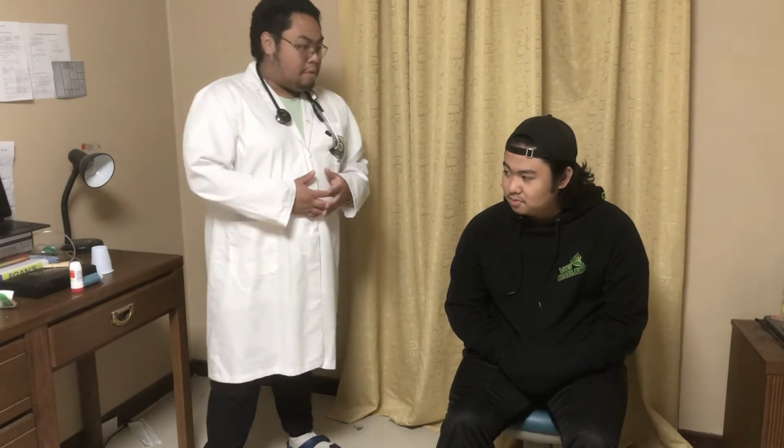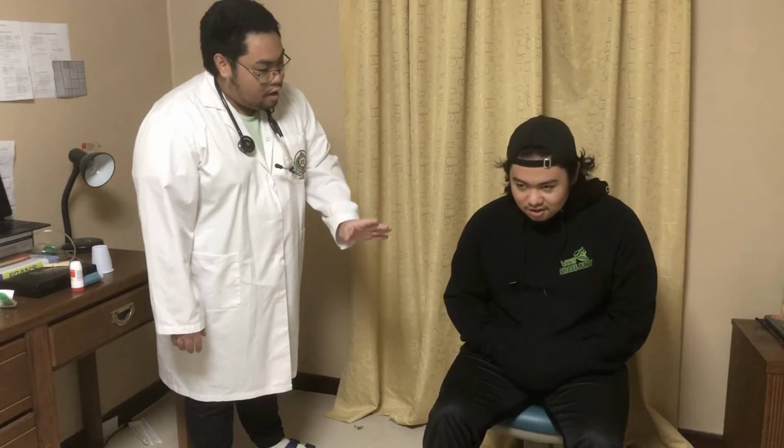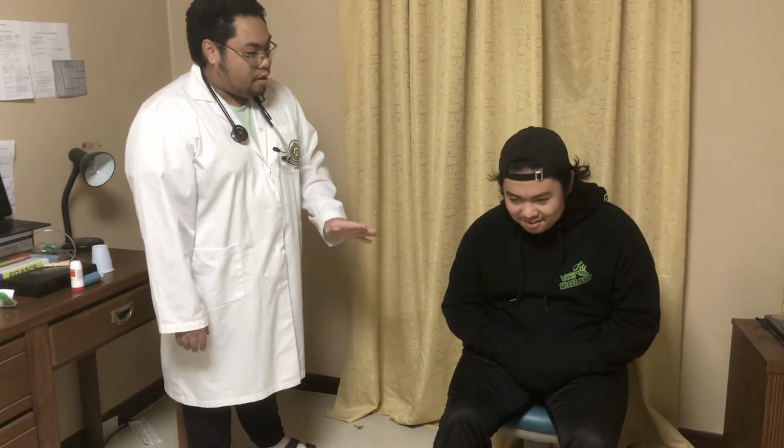Okay? Until the test. So now, let's do a little bit of a return demonstration of it before starting it up. Inhale, exhale. Inhale, exhale. Inhale, exhale. Now, inhale, exhale. Inhale, exhale. Make sure that the patient is maximally inhaling and exhaling at the same time. Now for the test.